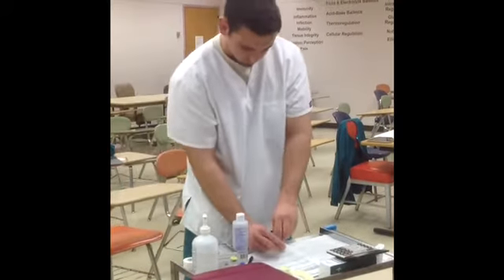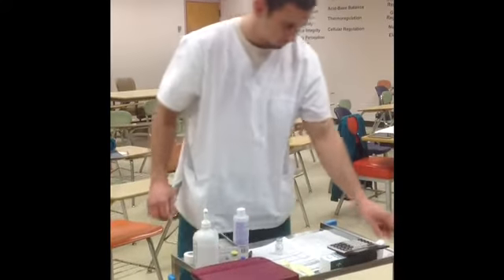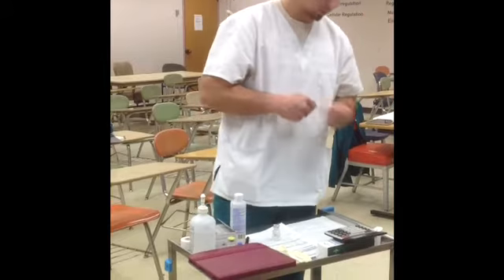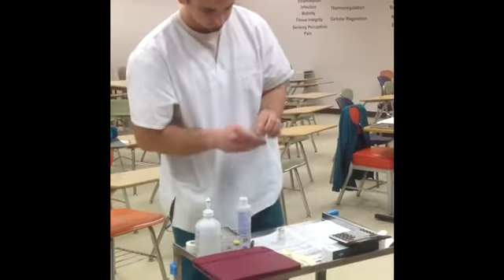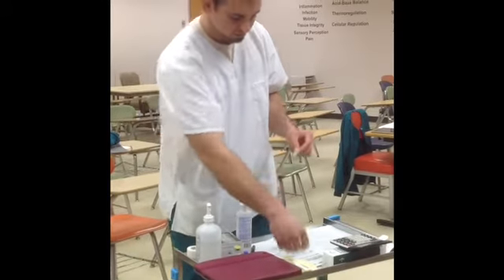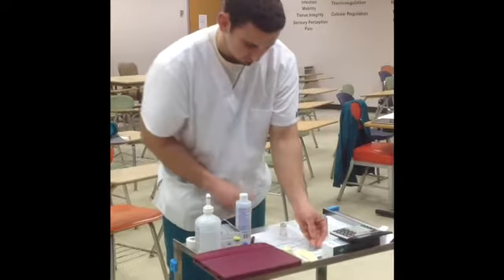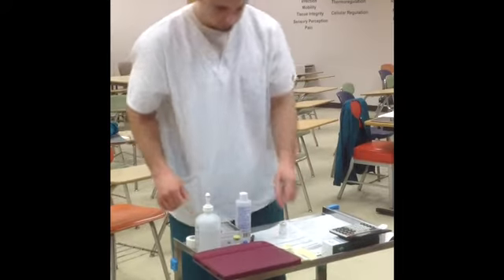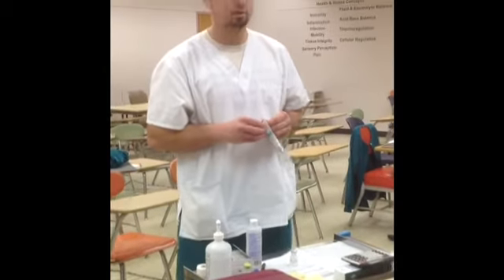Okay, so the first thing I want to do, open up my med, use my first, because I get 2 alcohol pads, I'm going to use one first. I'm going to clean out the top of this. Okay. So like I said earlier, I'm going to draw up 1.2 mLs of Bacillin.